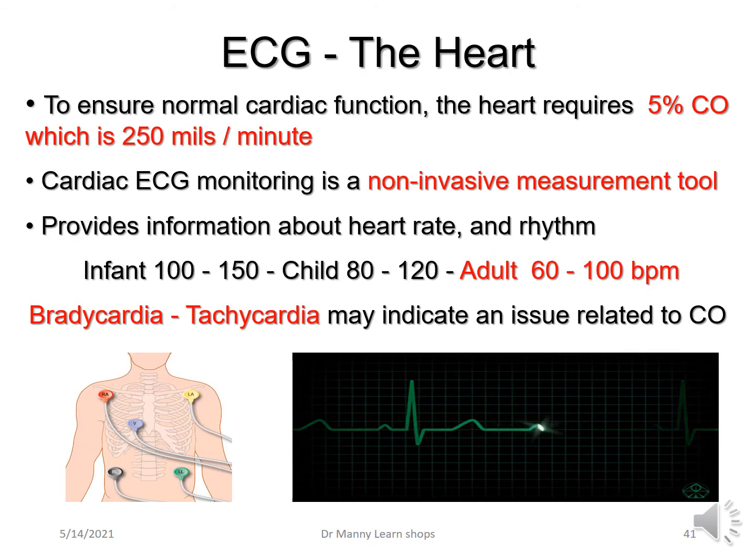Then you've got the ECG. The ECG, cardiac monitoring of the heart, is a non-invasive tool that ensures normal cardiac function. The heart requires approximately 5% of cardiac output, which is about 250 mils per minute. Cardiac ECG monitoring is a non-invasive measurement tool. It provides information about the heart rate and the rhythm, and whether it's regular or not.